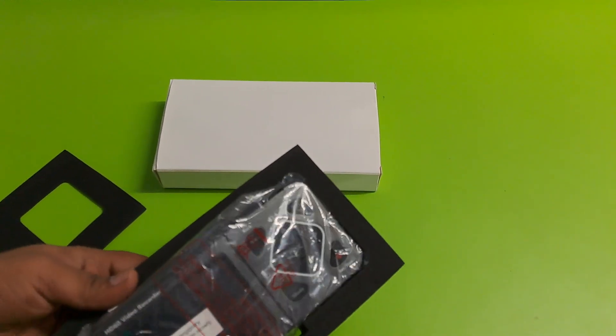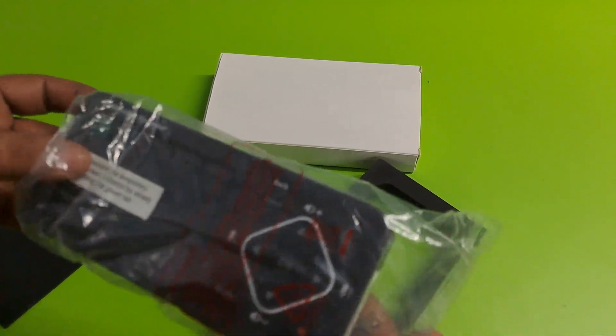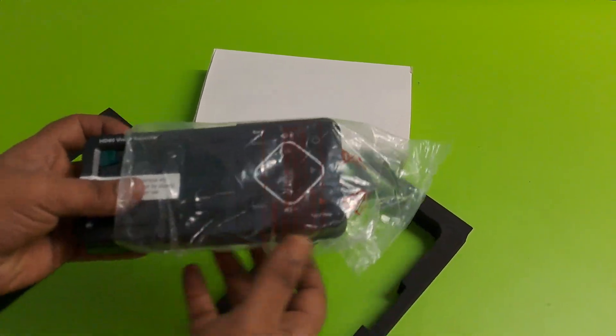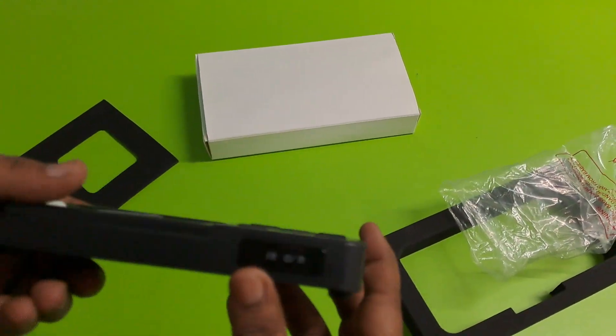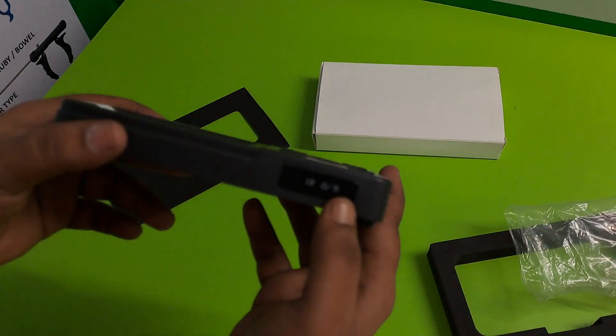This is our HD video recorder. 60 fps. This is AR Power HD.